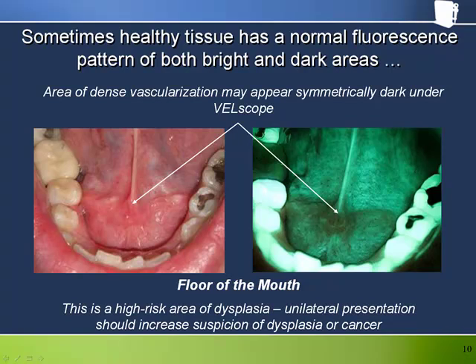Although the symmetry and shape of this dark area under Velscope is suggestive of normal tissue, the floor of the mouth is a high risk area for dysplasia. Watch out for non-symmetrical areas giving a unilateral presentation — these should increase suspicion of dysplasia or oral cancer.